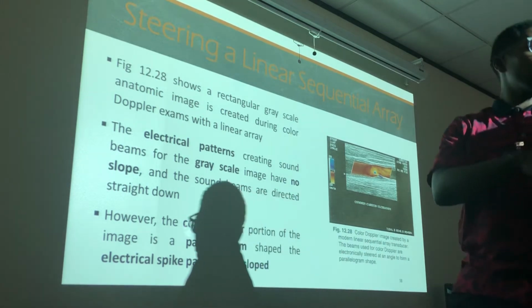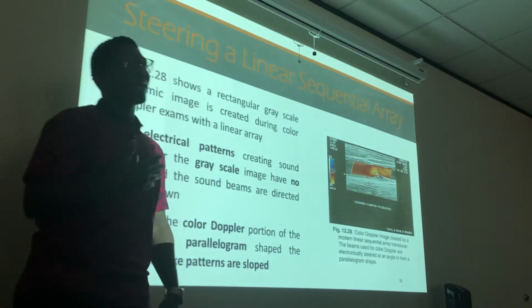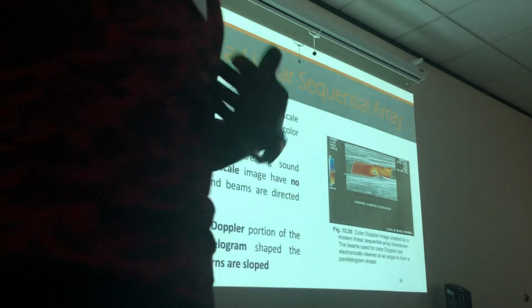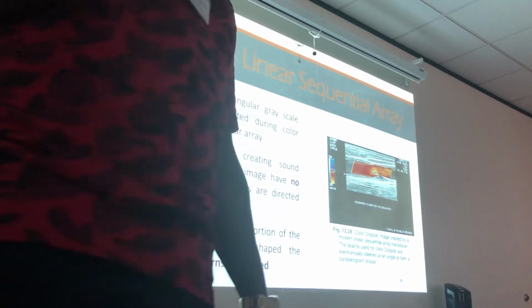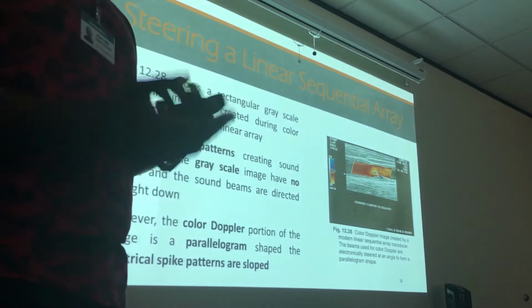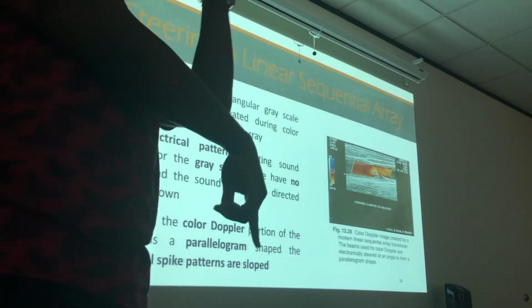If you have that main portal vein straight across the screen, perpendicular to the beam, you're not going to get good fill-in on that vessel. That's why the texts tell you to come in between the ribs so you can get it going towards the transducer. That's the purpose of Doppler: it's not going to work for you if you don't have the anatomy directed towards the transducer or away from the transducer.